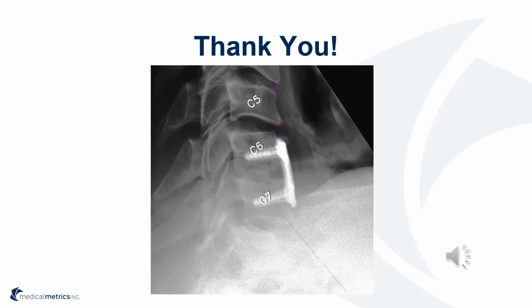Thank you for considering how image stabilization, combined with quantitative metrics, might lead to more accurate diagnosis of pseudoarthrosis after spine fusion surgery.